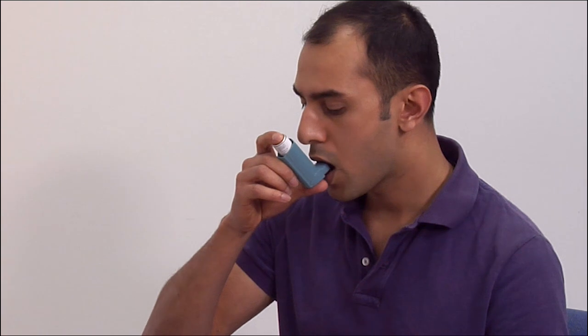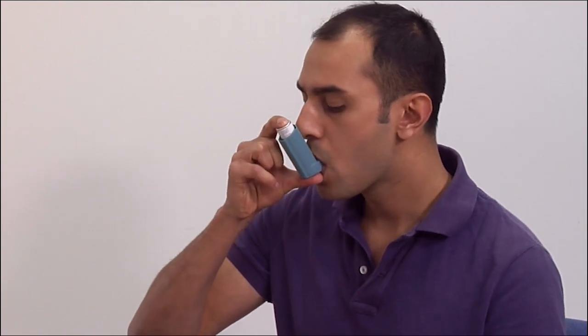Could you try that now for me? Very good. So now hold that for 10 seconds. At this point, ask your patient to take another dose, checking for correct technique. Check that no mist escapes from the patient's mouth.